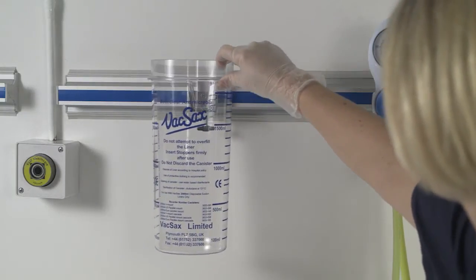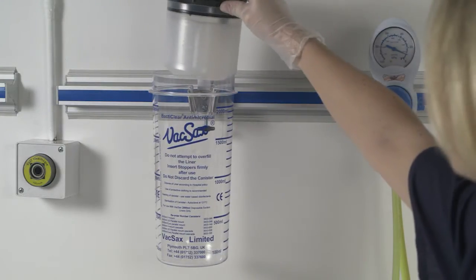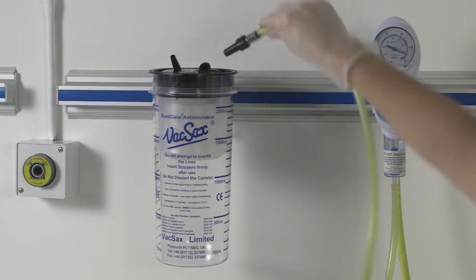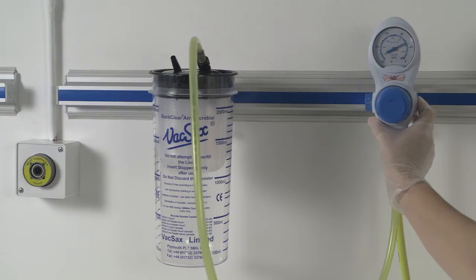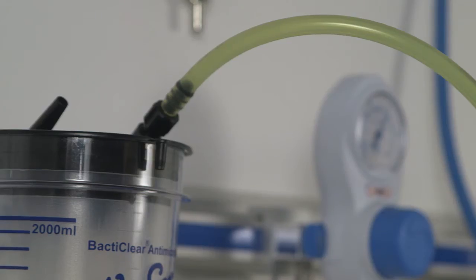Start by placing the 2 litre canister into the wall bracket. Place the black lid liner into the canister and press home firmly. Connect the black vacuum tapered connector into the vacuum port located on the liner lid. Set the vacuum to maximum, turn on, and inflate the liner fully within the canister.